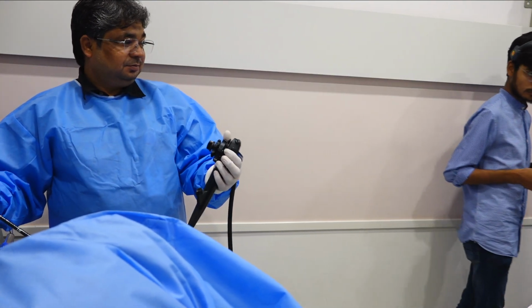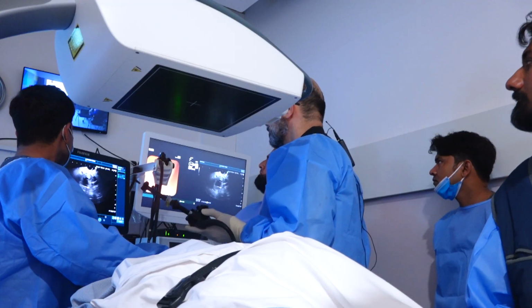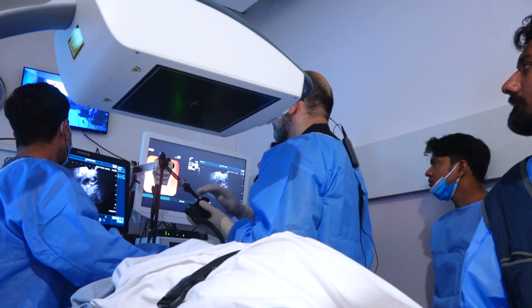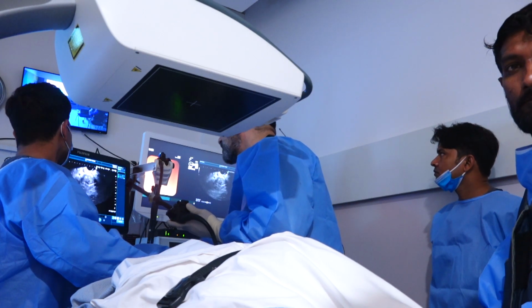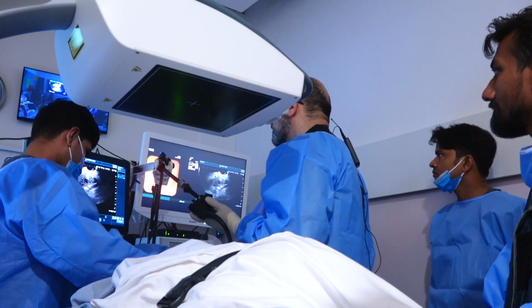Okay. So you can see. Mustafa, we are back with you, but we don't have the visuals, but we should have them in a second. Okay. I'll wait. Just give us a second. Yeah, we are with you. We can see you and your lamps. I don't know if you need to see Axios or if you need to just see the EUS or fluoro. We will see the EUS.